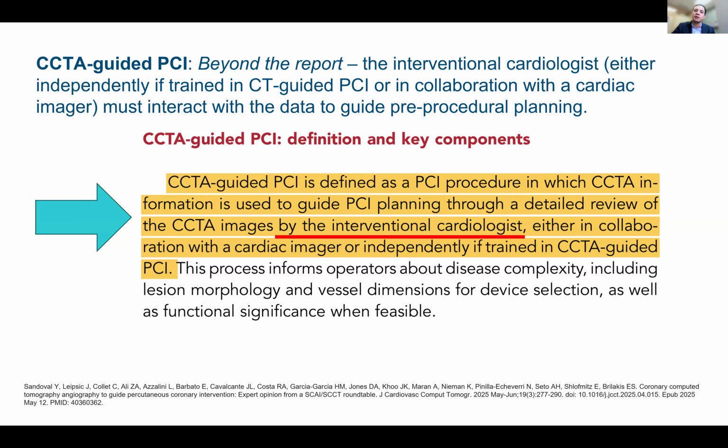need to embrace the desire to interact with this information to help with PCI planning. The interventional cardiologist can do that alone if they train in how to look at these images, or of course in partnership with the imagers, looking at them together. I would say it's probably a bit of a hybrid depending on the case.